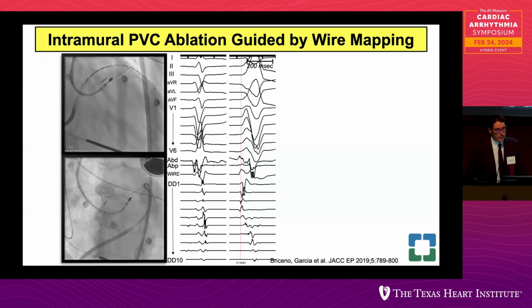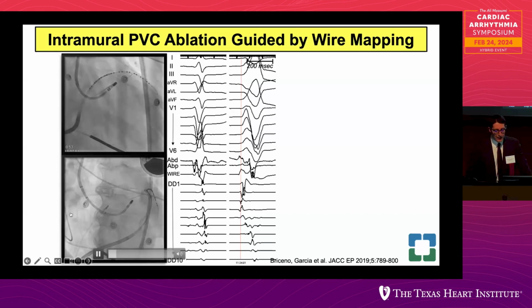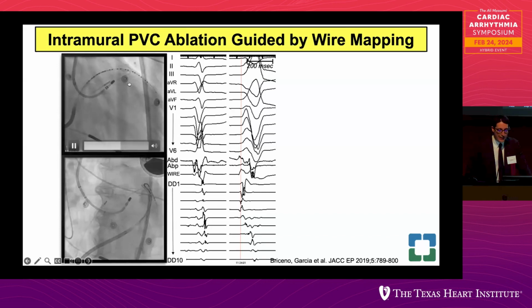Now, you cannot ablate from the guide wire, nor can you ablate from a multipolar catheter in that location. So for these procedures, 80% of the time, you can get the job done by ablating the closest anatomical site that you can access with your ablation catheter. So you do use something that we call an anatomical approach. Essentially, you deploy your ablation catheter at a site that is as close as possible to the guide wire.